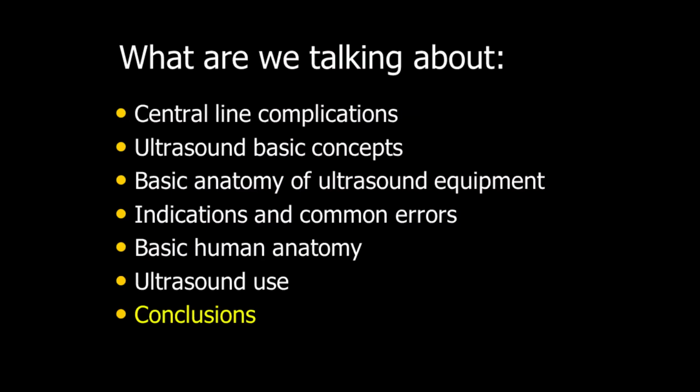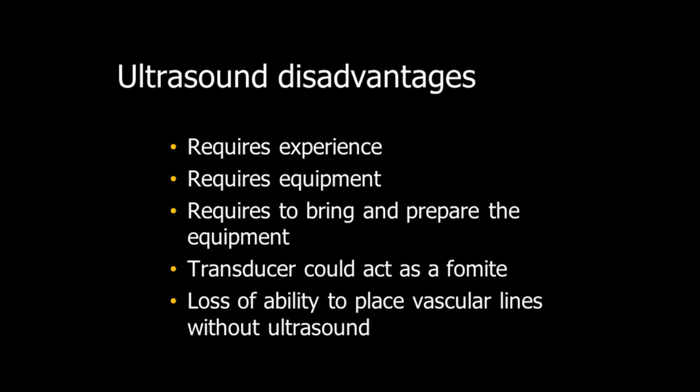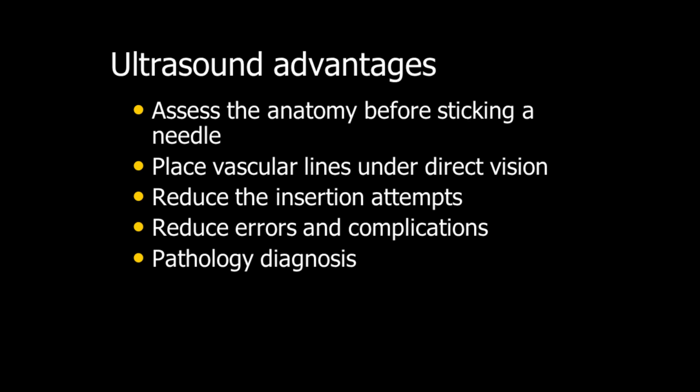And in conclusion, you require experience and, of course, equipment. You have to be prepared, and understand you have to clean the transducer between patients' use. You also could lose the ability to place vascular lines without ultrasonography, and that's something always to consider. It's always good to assess the anatomy before sticking the needle, and place the vascular lines under direct visualization. This reduces insertion attempts and reduces complications, and also helps you diagnose some pathologies.